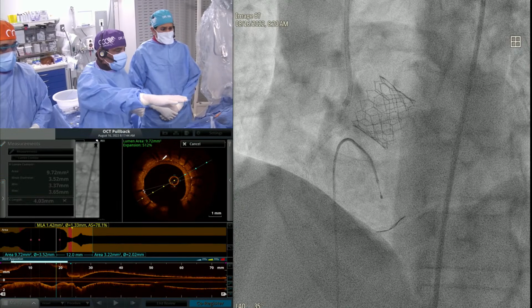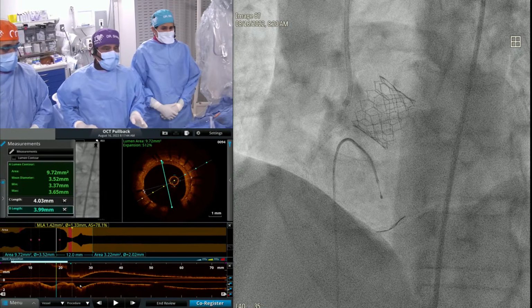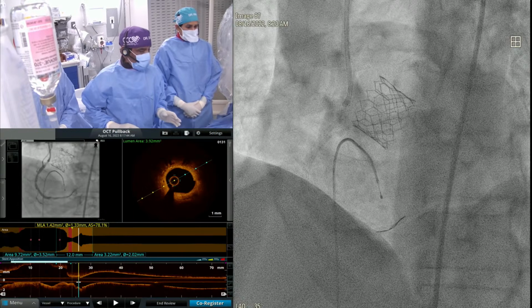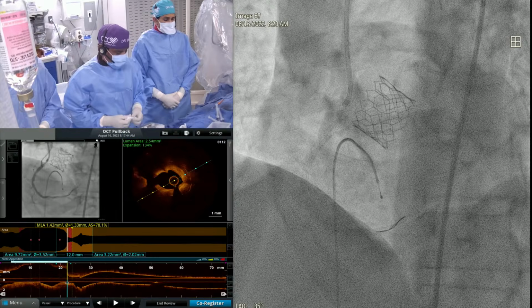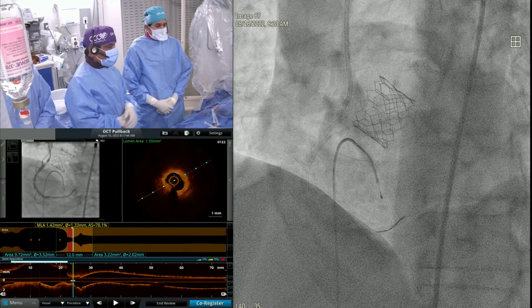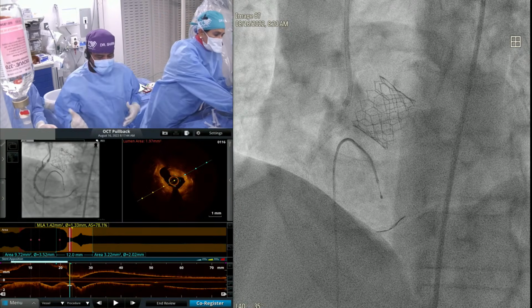Look, all I can tell you is that doing imaging here was the most critical. It gives you a much clearer idea, probably less of a role for IVL or rotational ablation, and probably a very good case for the laser. Laser plus high pressure balloon, as you said. IVL definitely does not have a role because there is no calcium.